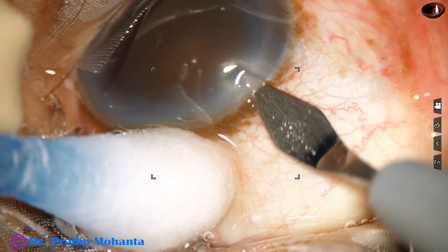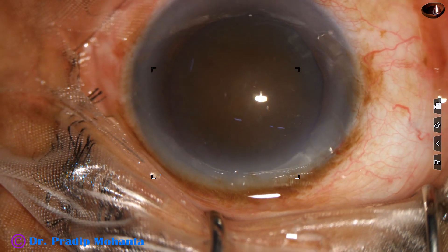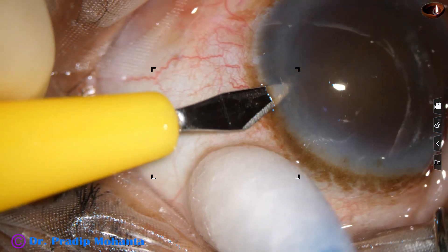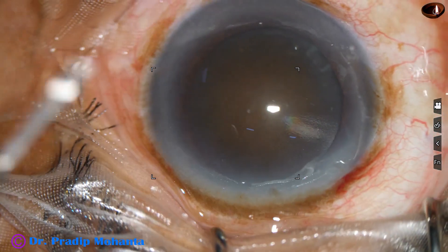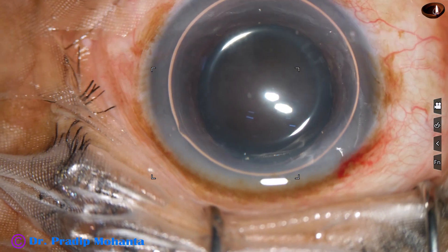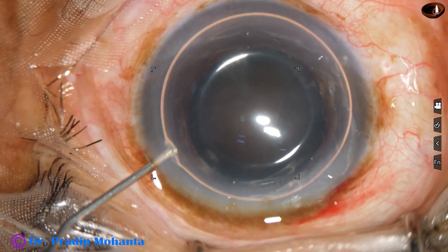This is the main incision with a 2.8 millimeter steel keratome at around 11 o'clock. A side port is made on the left side of the main incision, about three clock hours away. Then an air bubble is injected into the anterior chamber.